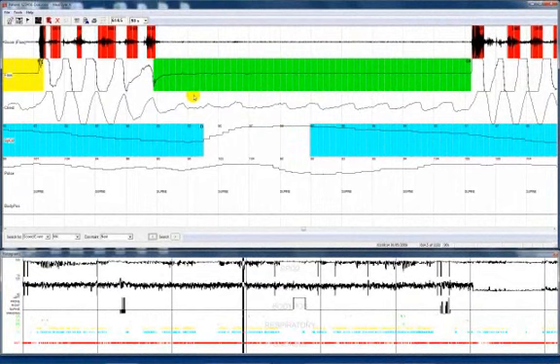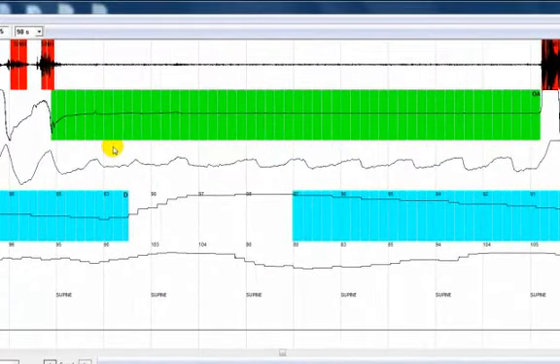First, let's discuss apnea. There are 3 types of apneas: obstructive, central, and mixed. And obstructive apnea is defined as a cessation or stoppage of breathing of at least 10 seconds during the night. This means the person stops breathing for 10 seconds or longer, and that is why it is absolutely essential that a device that records airflow is used to define and record sleep apnea.